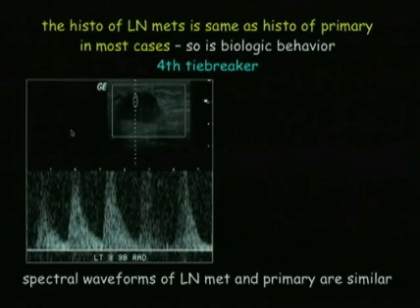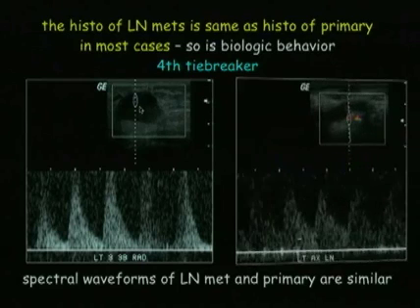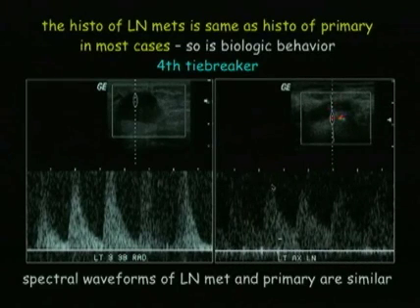Now, the literature varies as to whether you should have high or low resistance patterns within a breast cancer, but the truth is, in the peritumoral tissues, you tend to have a low resistance pattern with rounded systolic peaks, but anytime you go into the center of a lesion, probably because of the oncotic pressure from stuff that leaks out of the abnormal leaky tumor vessels, you tend to have compressed sinusoids and you have a high peaky systolic flow and a high impedance pattern. So when the primary has that sort of pattern from inside the tumor, you'll see a very similar pattern within the lymph node vessels. So high peaky systolic flow and high impedance flow is typical of metastatic disease.